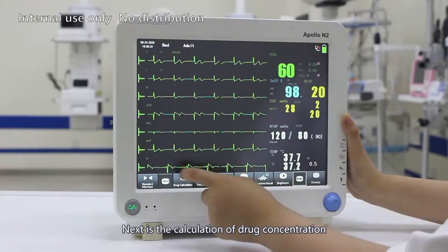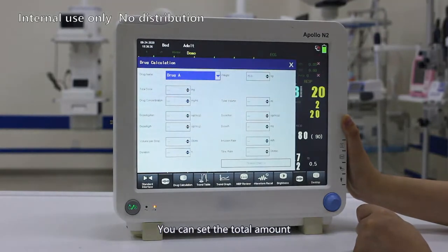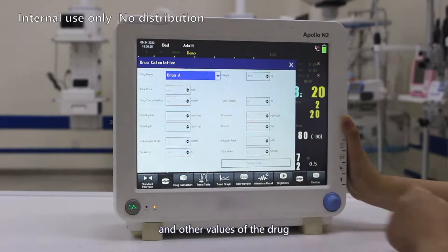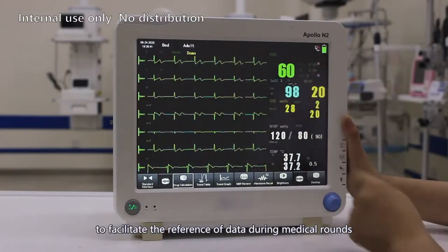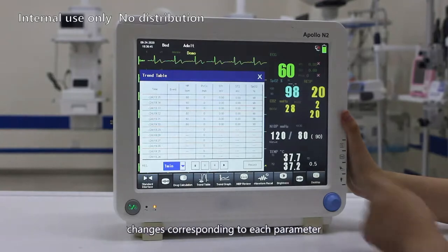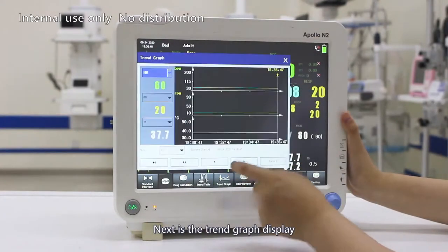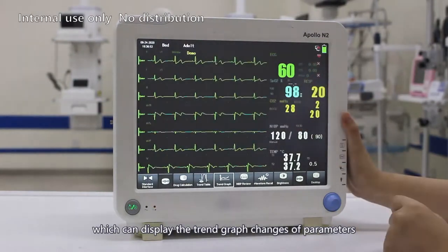Next is the calculation of the drug concentration. You can set total amount, concentration, dose, and other values of the drug to facilitate the reference of data during the medical rounds. Next is the trend table display. You can view the parameter changes corresponding to each parameter. Next is the trend graph display, which can display the trend graph changes of the parameters.